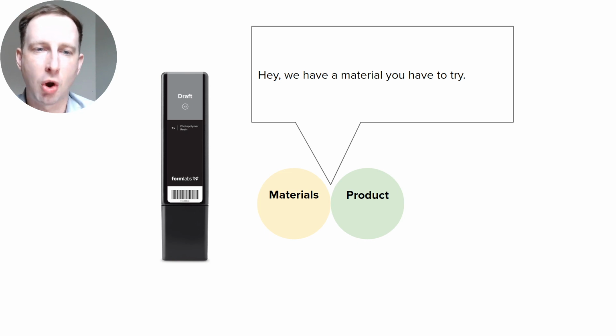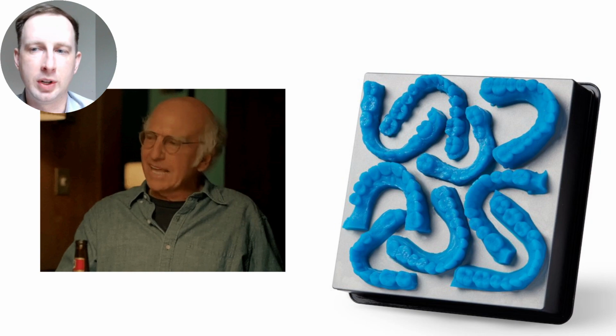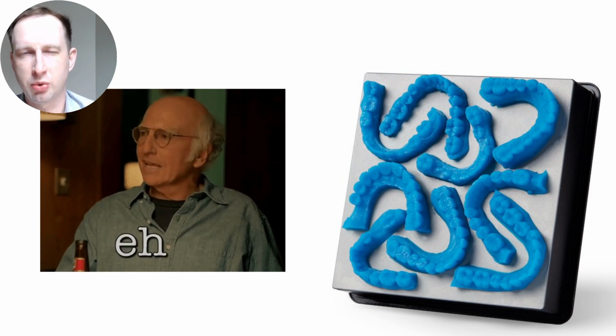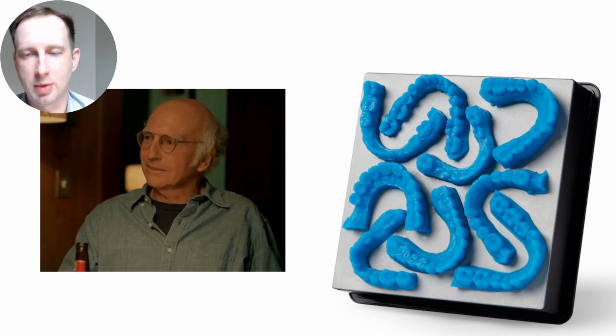So over the summer in 2020, the materials team came up to me and said, hey, we have a material we'd like you to try. It's Draft V2. And we had a version 1. It was okay. I didn't love it. It was not the most accurate material in the world. It was 300 micron layer height. It was fast, but it was just okay.